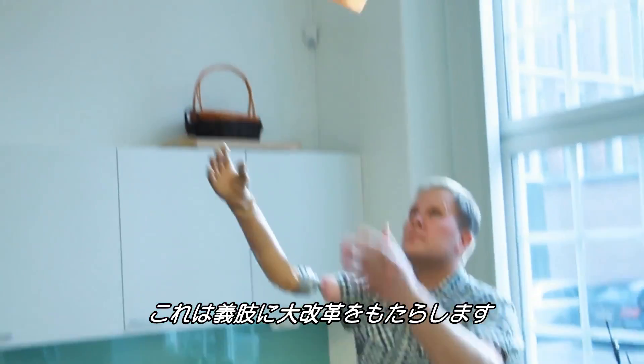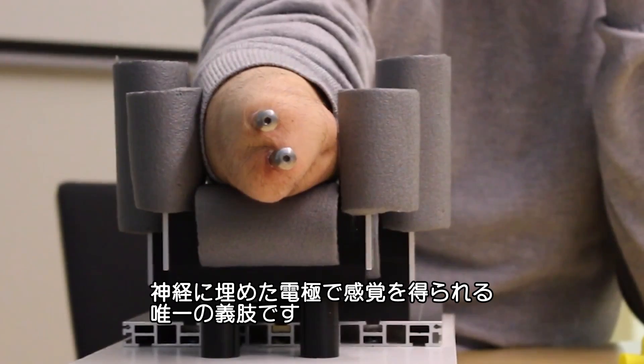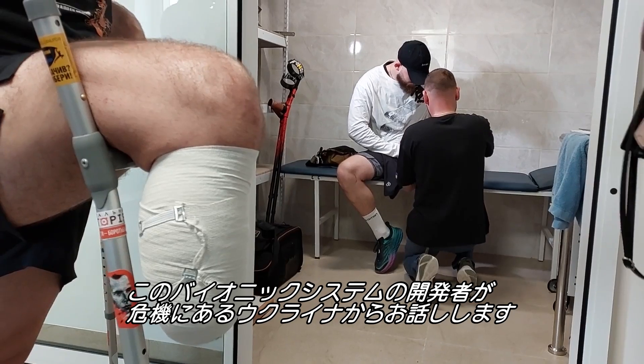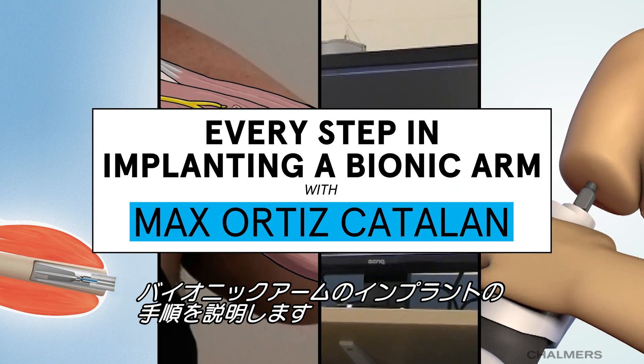You're looking at a game changer in prosthetics — the only one today using electrodes implanted in the nerves to provide sensation. The developer of this bionic system is speaking to us from Ukraine, where war has led to a crisis: more than 15,000 people with amputations in the country. Let's walk through every step needed to implant his bionic arm into a patient.